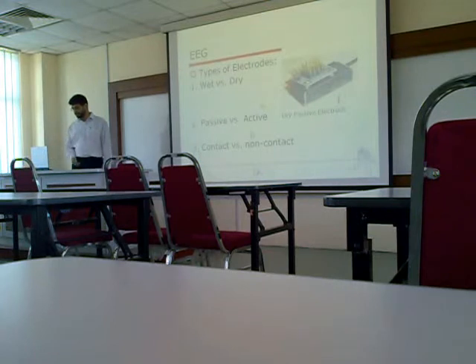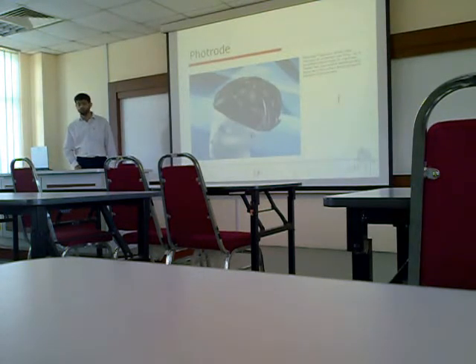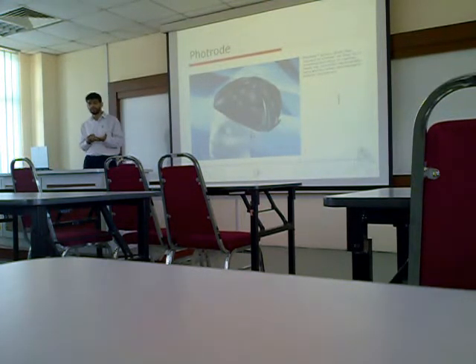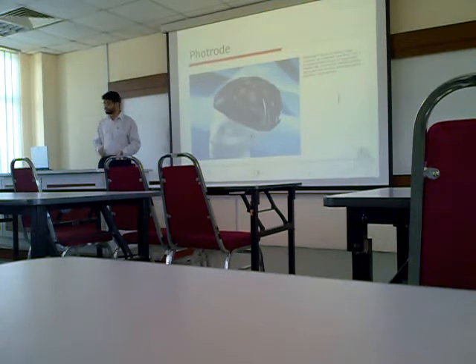And there are contact and non-contact electrodes. Recently there is a proposed method to use lasers that transmit a light signal onto the scalp. When it is reflected, there are changes in the frequency and the phase, and that will be correlated with the electrical changes in the underlying tissue.